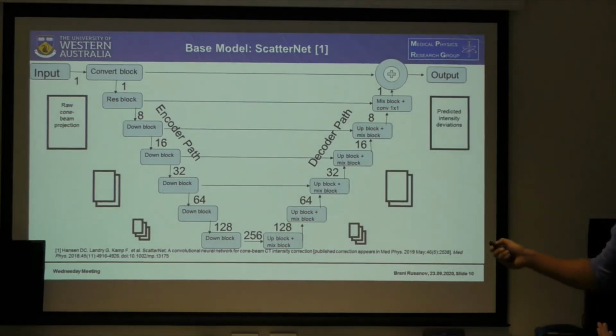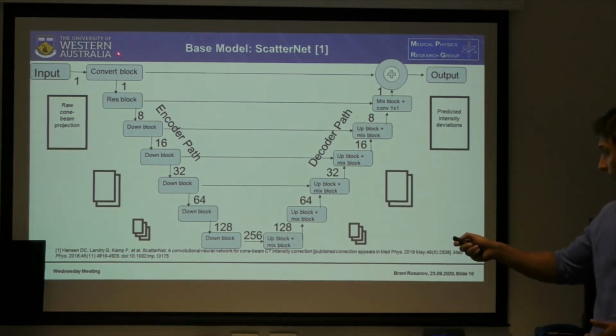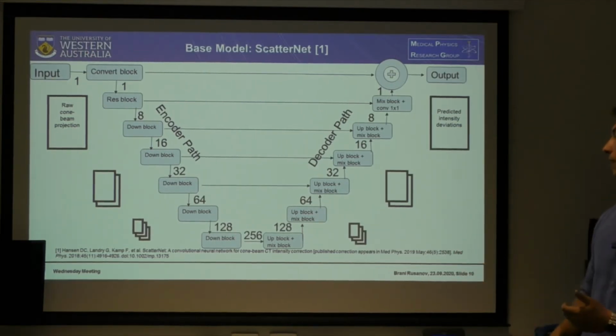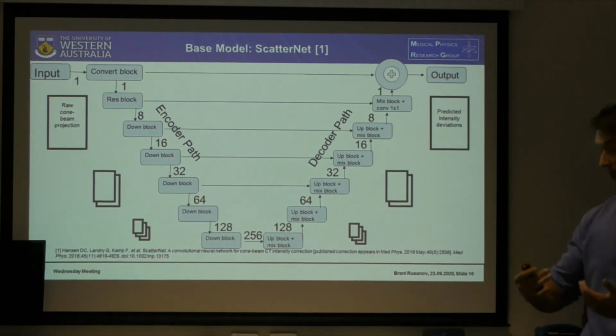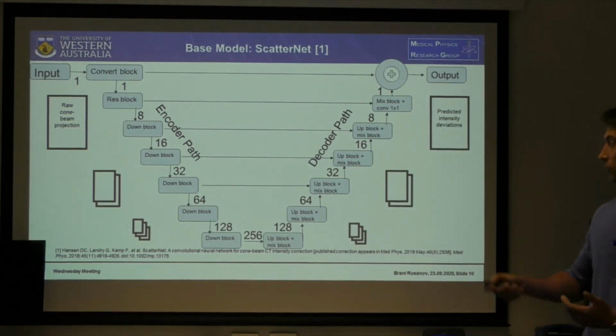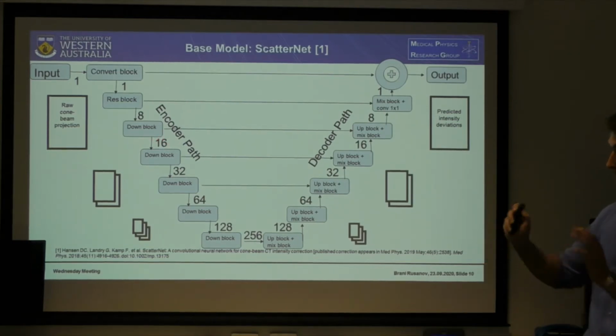So essentially what happens, I won't go too in depth because this will take hours and hours, but essentially the raw cone beam projection is input, and the image travels along the encoder path. Along every single block inside there are many convolution kernels, each having thousands and overall millions of learnable parameters. So essentially what happens is matrix multiplication between the input image and the various filters or kernels contained inside every block. The output of every layer is seen next to the, sorry, I should clarify.